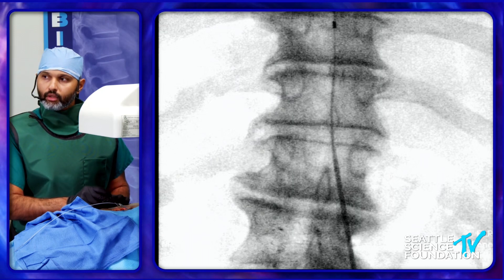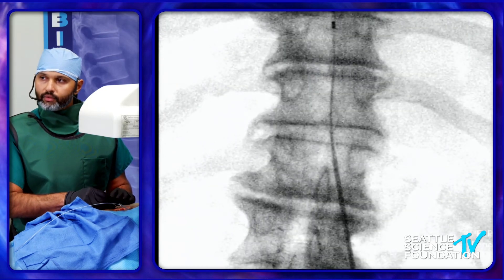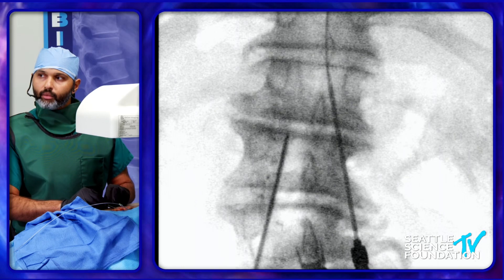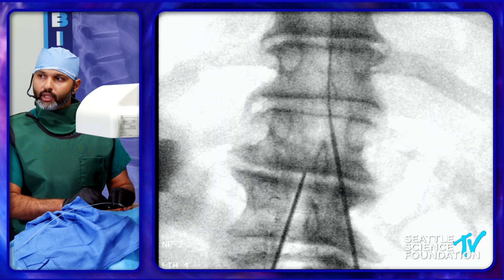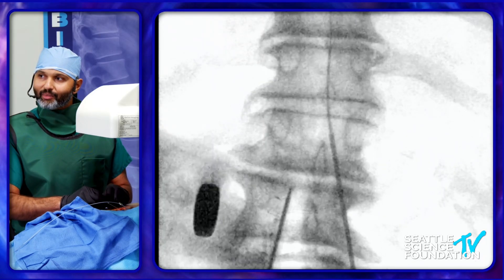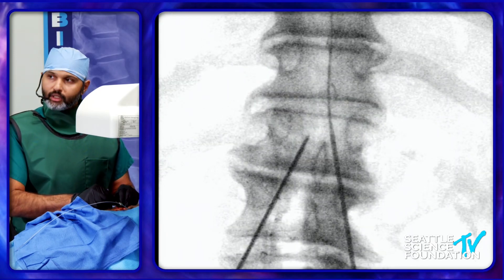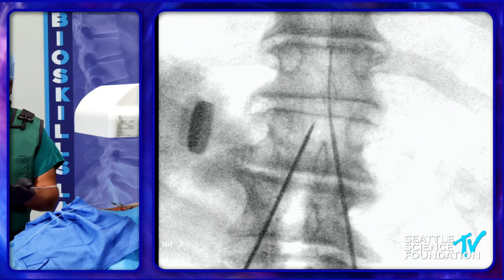With this open, I'll take the same approach as before — just paramedian, same degree, 30 degrees or less. The flatter the needle, the better. We'll advance this in here following the interlaminar space. There's been a lot of cut-down here — patients have failed a lot of therapies. So we'll go in here, kind of enter the space, and put the leads in just how we had it. We'll use loss of resistance with saline.